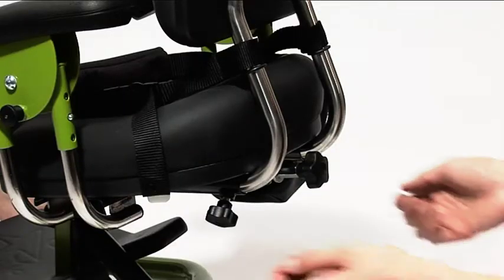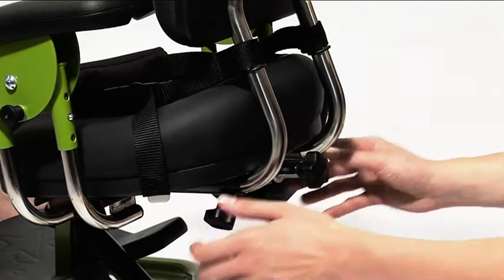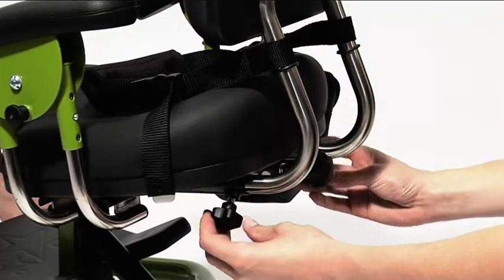To adjust the depth of the lumbar prompt, loosen the handwheels. Slide the lumbar prompt tubes in or out to the desired position and then re-tighten the handwheels.